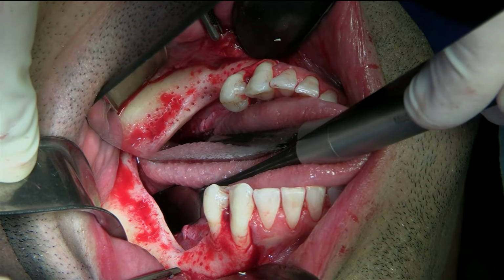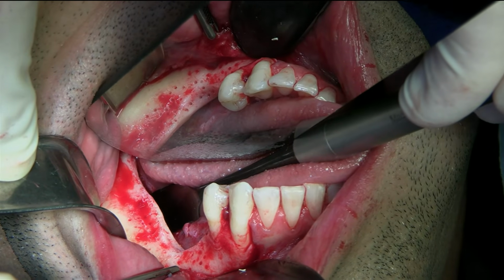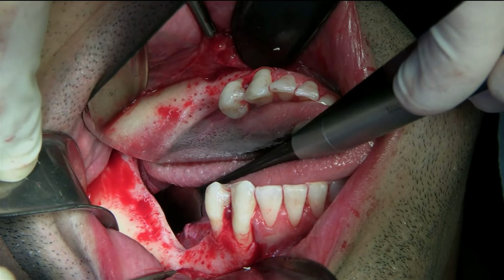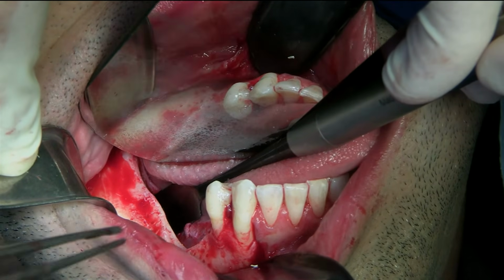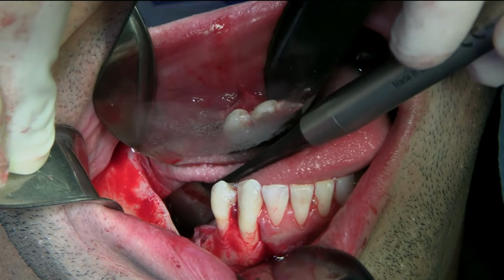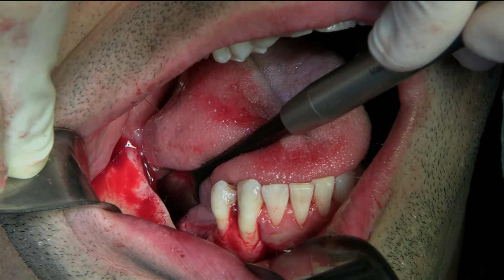Okay, you can see all the perforations. You can see the nice, clean, full thickness flap elevation. And of course you can see the mental foramen. And the bone we took all the way from the posterior, so no problem. So that seems to be ready for us to start preparing the membrane. And we'll probably need like a good ½ gram of xenograft. Okay. So we can open the xenograft and then let me have the membrane so we can start preparing it.